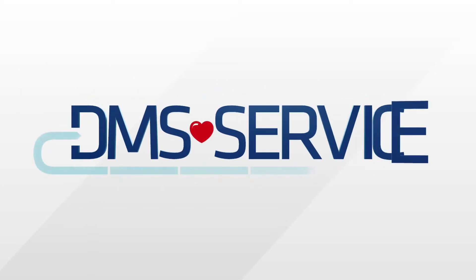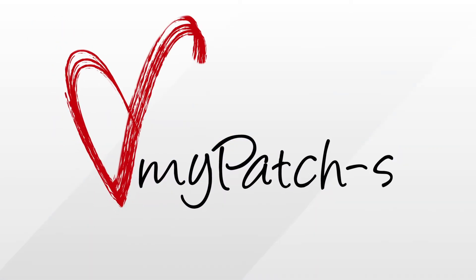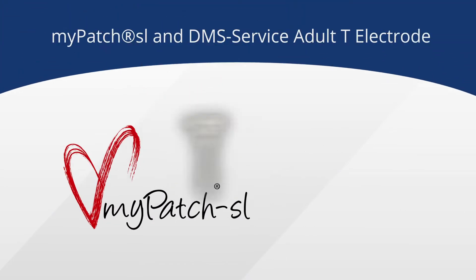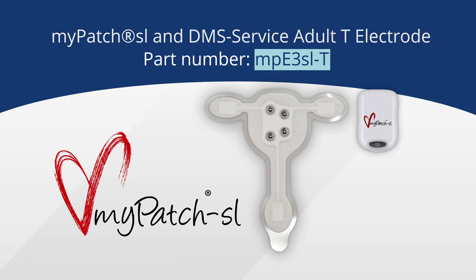DMS Service welcomes you to our How-To video series. In this video, we'll walk you through the simple steps of hooking up the patient to your MyPatch SL using the MyPatch SL Adult T electrode, which to confirm is part number MPE3SLT.